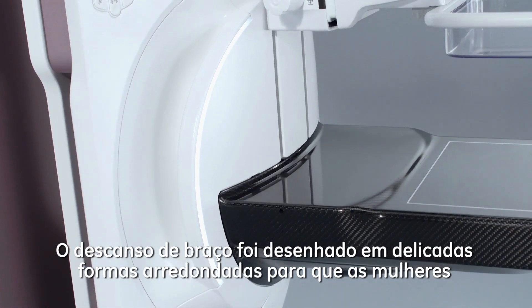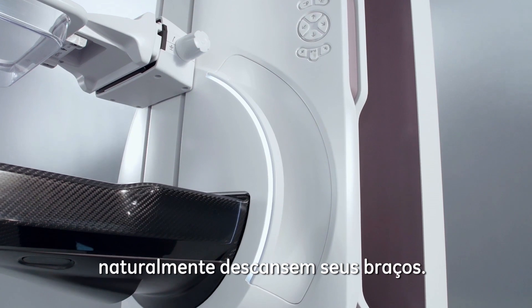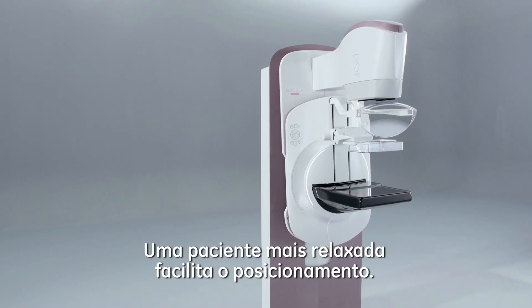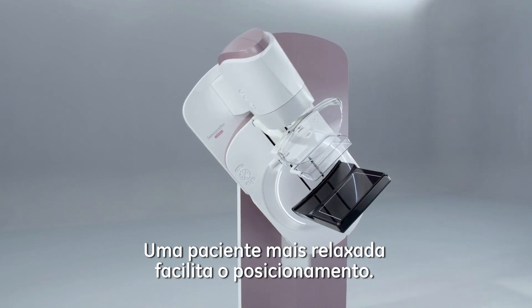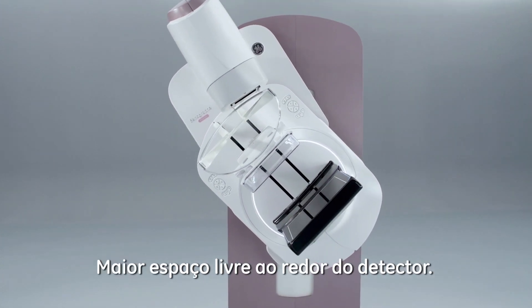The armrests were designed in a rounded and caring shape for women to find a natural way to rest their arms. A relaxed patient makes it easier for positioning. Clear spaces are available all around the breast support.